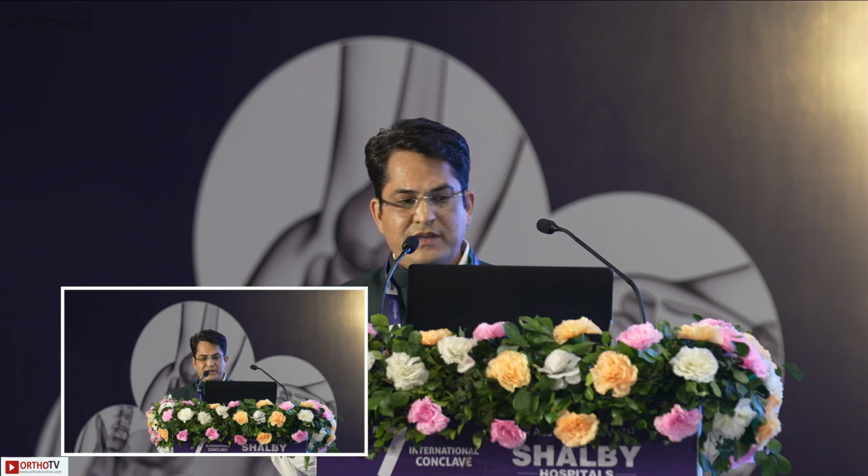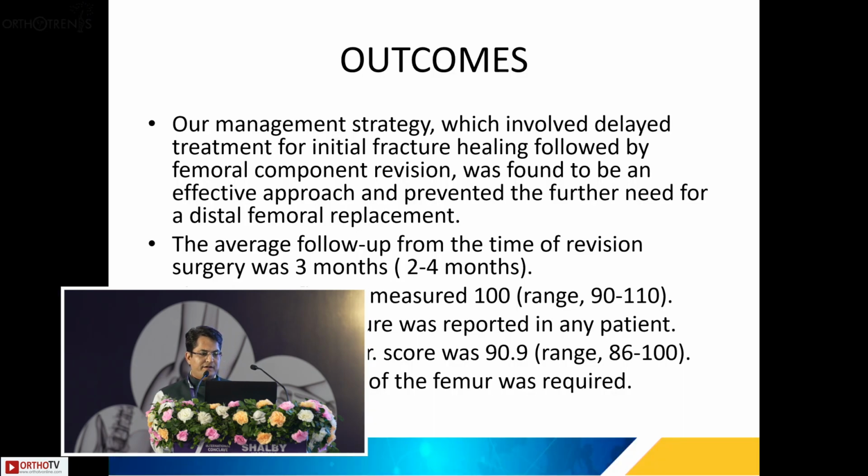In this series of 3 patients, our management strategy, which involved delayed treatment for initial fracture healing followed by femoral component revision, was found to be an effective approach and prevented the further need for distal femoral replacement. The average follow-up was 3 months. Average flexion was around 100 degrees. No flexion contracture was reported in any patient. No tertiary revision was required to date.